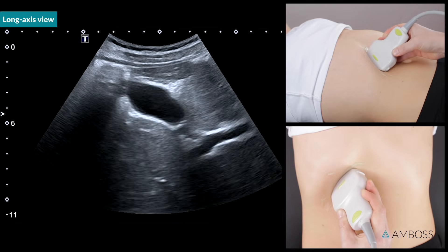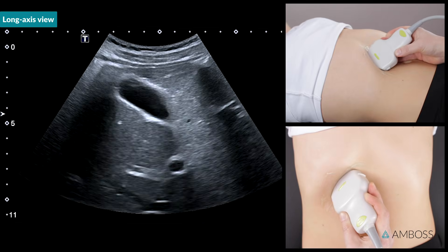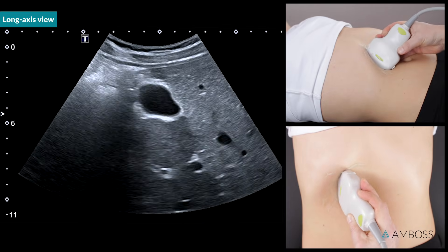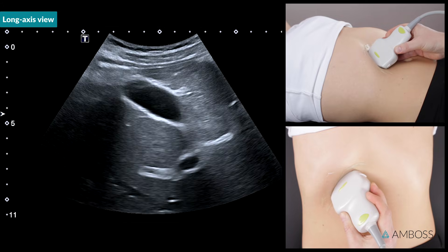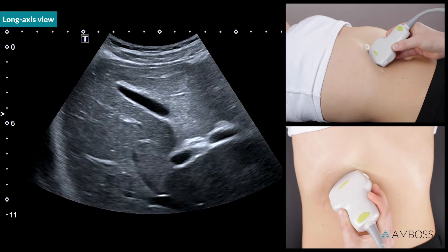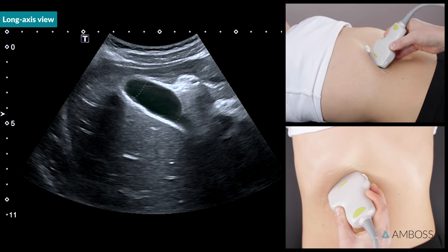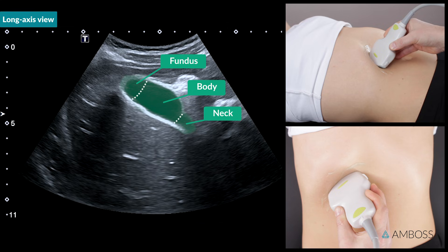Once you've identified the gallbladder, rotate or slide the probe as needed to obtain a full long axis view. In this view, the gallbladder fundus, body, and neck are visible.